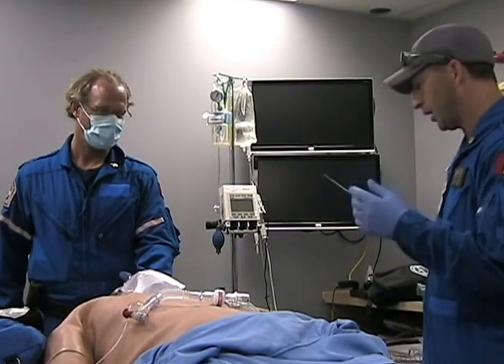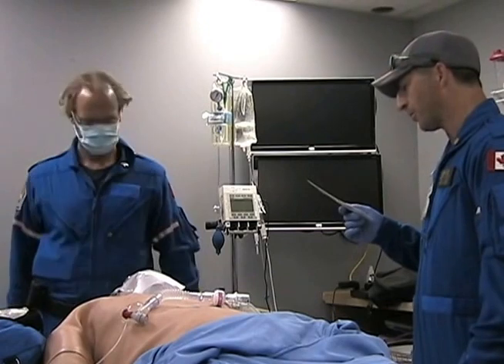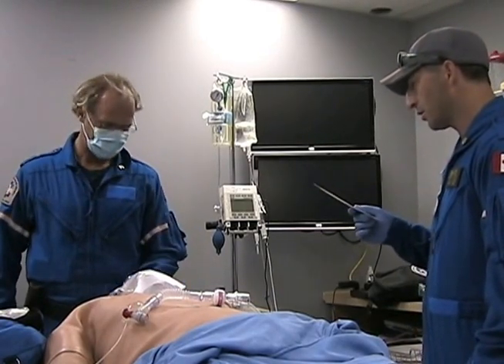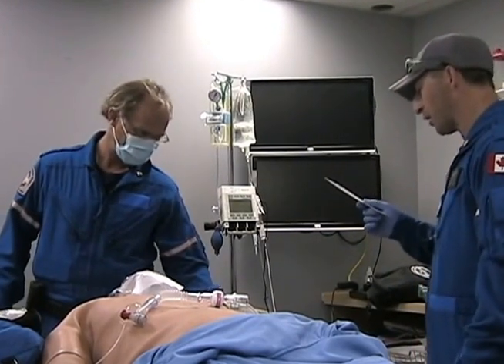Okay, sounds good. PPE, gloves, mask, goggles. Done. BVM plus or minus PEEP valve, it's right here. OPA plus or minus NPA. OPA and NPAs are both in. Suction tested. Suction has been tested. Laryngoscope tested. It has. Plus or minus C-MAC on. It is, yeah.